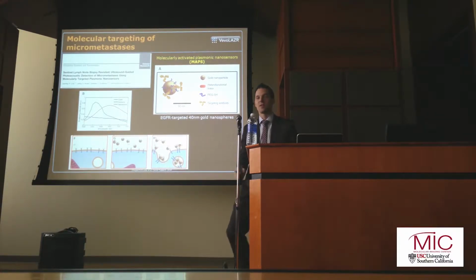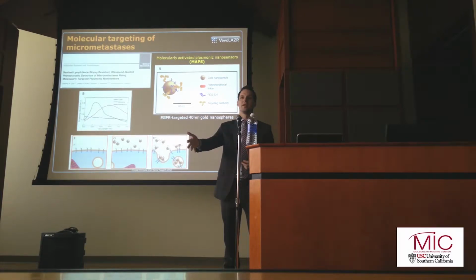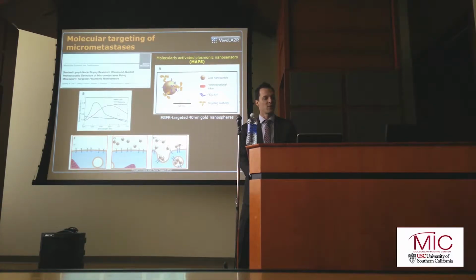In the second case, they had their particles, and they put their particles in the dish with the cells. The particles were not targeted, okay? So they just floated around in the extracellular space. And they found that they did get this nice absorption curve coming from the nanoparticles, not surprisingly, and that's this green curve here.